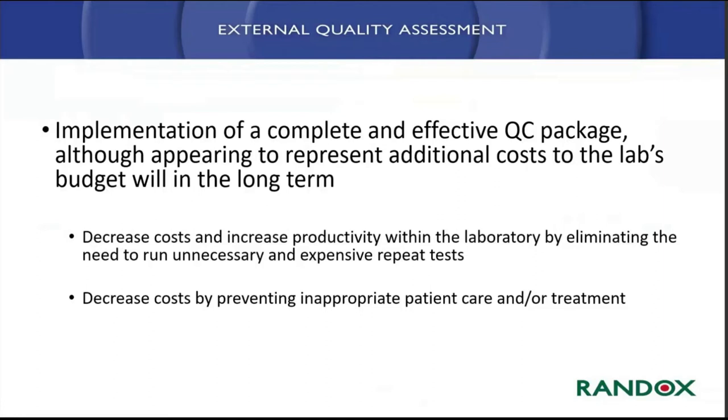Why run EQA? Why implement an effective, complete quality control package whenever it adds additional costs to your budget? However, if you look at labs that have become accredited, you will always find that in the long term, it will decrease your costs. Maybe not within the individual laboratory so much, but certainly throughout the whole system within your hospital or the circumstances that you find yourself in. So there is a decreased cost and increased productivity within the laboratory, especially by eliminating the need to run unnecessary and expensive repeat tests. Once again, just to emphasize that we are looking to prevent inappropriate patient care and or treatment.